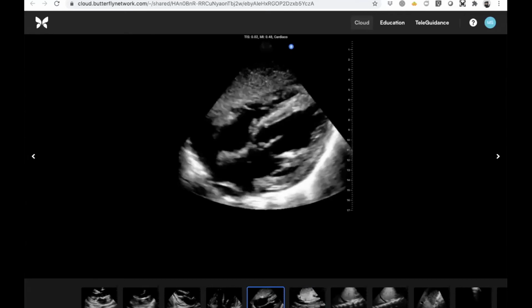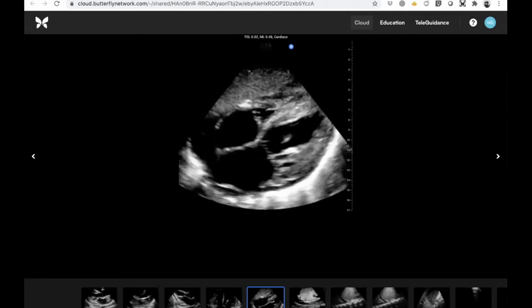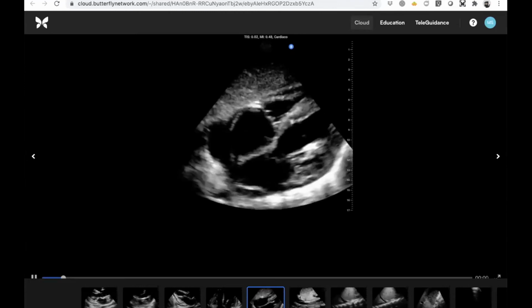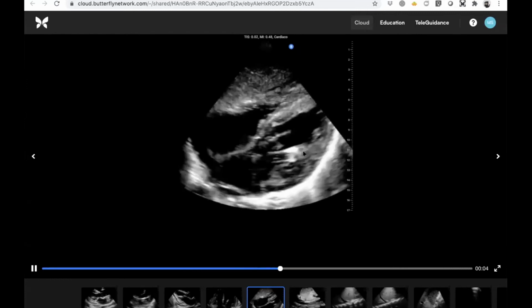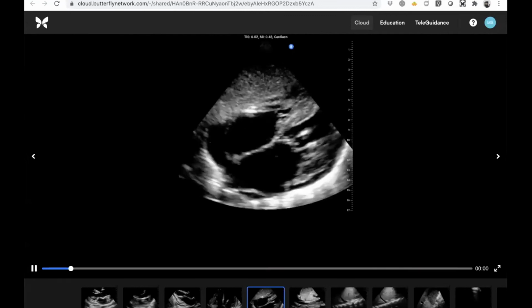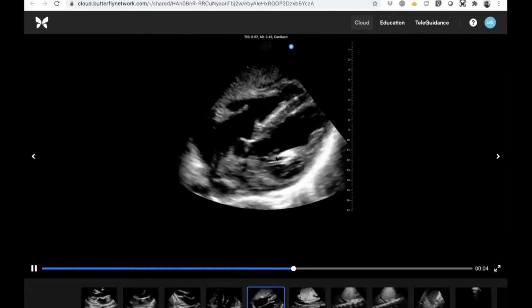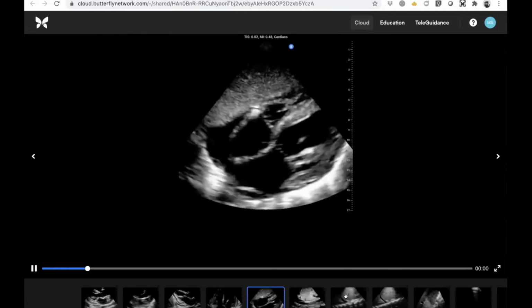I'm getting more and more convinced that it's part of the papillary apparatus there, but it is remarkably hyperechoic on that apical and on the parasternal long. It's a good indication that you still have pericardial fluid circumferential. It's small. It's not a large effusion, but it's definitely beyond just a physiologic effusion. So I think we'll wrap this study.